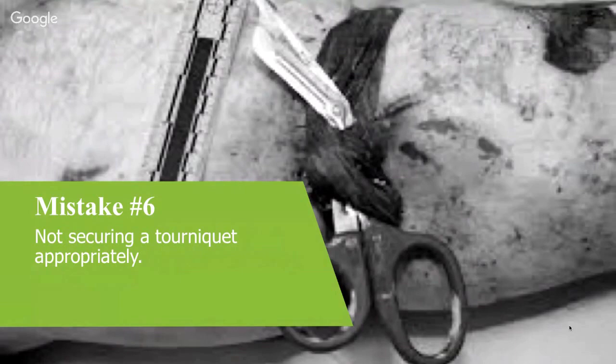Yeah, so look, the biggest point that we wanted to make on discussing it relates to, in terms of commercial tourniquets, the CAT tourniquet, and in terms of improvised tourniquets, it's really tough to secure an improvised tourniquet effectively, is the truth. There are so many variables involving what kit you've used, what you're tying it off with, the environment, that we won't touch on the improvised too much. It may be that if the situation dictates, you're stuck there just holding the windlass tight until a higher level of care can arrive. That may not be tactically appropriate, but the point being, you've got to secure that thing.